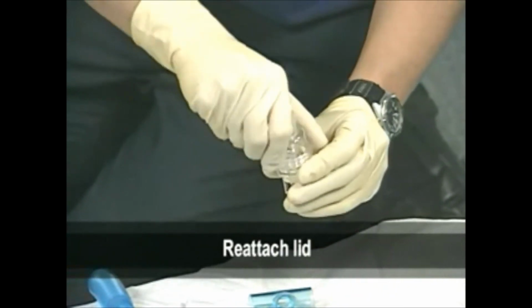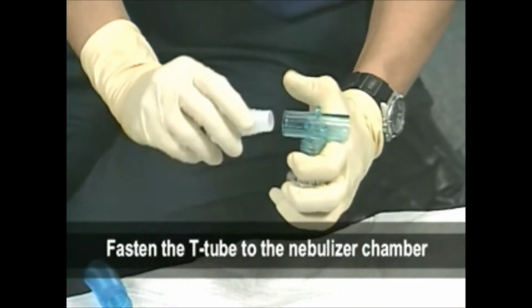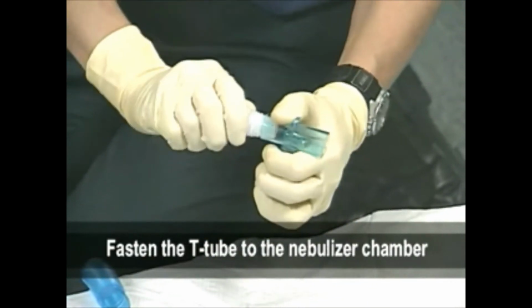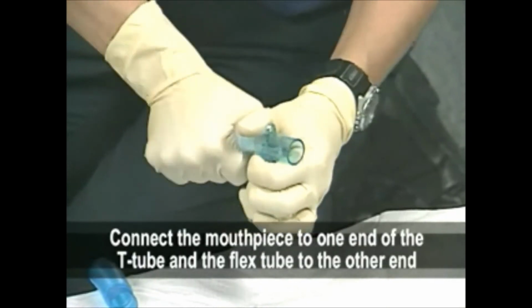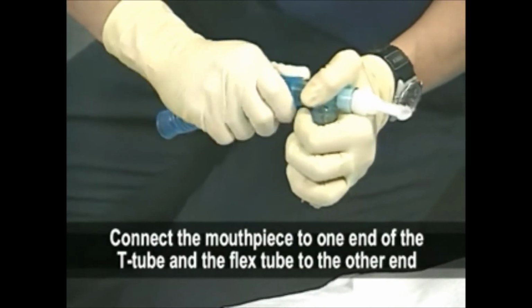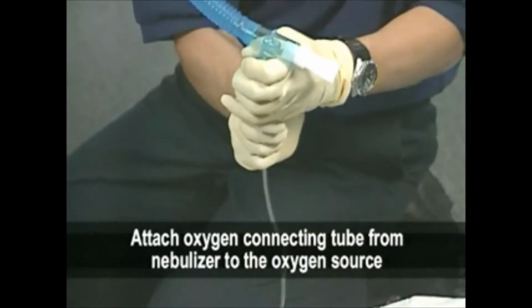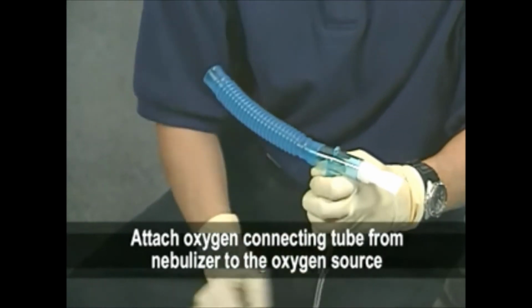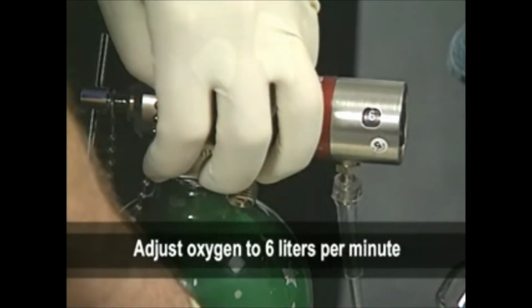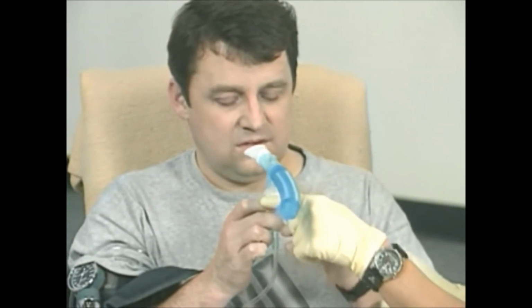Reattach lid. Fasten the T-tube to the nebulizer chamber. Connect the mouthpiece to one end of the T-tube and the flex tube to the other end. Attach oxygen connecting tube from nebulizer to the oxygen source. Adjust oxygen to 6 liters per minute. You should be able to see a mist coming out of both the flex tube and the mouthpiece.